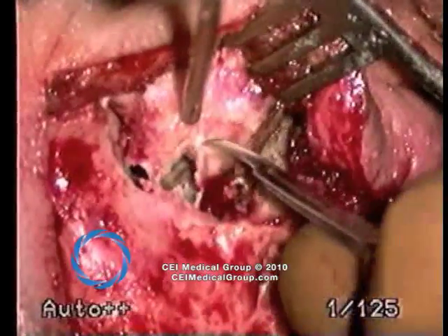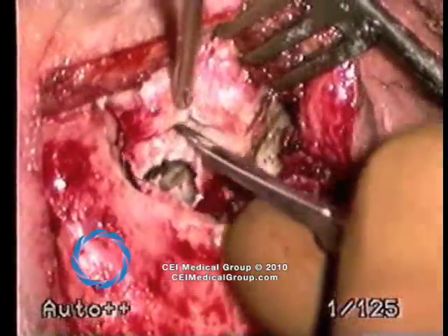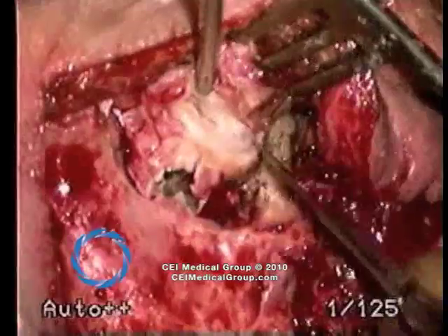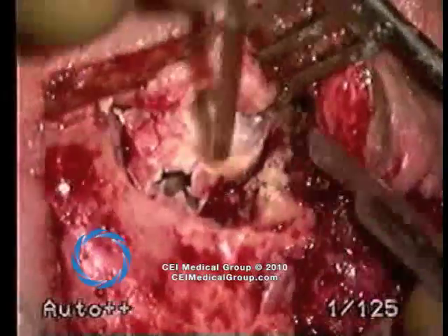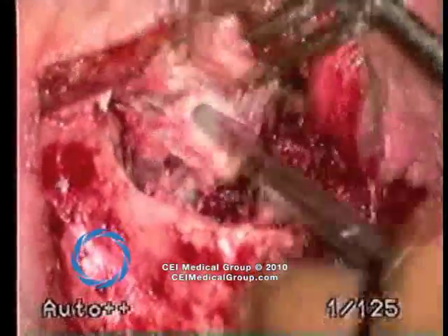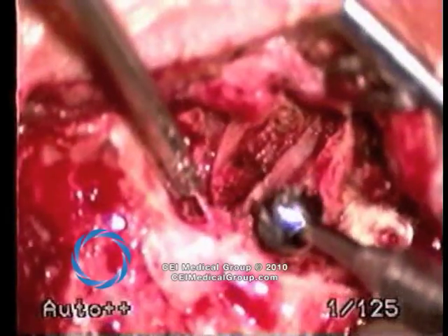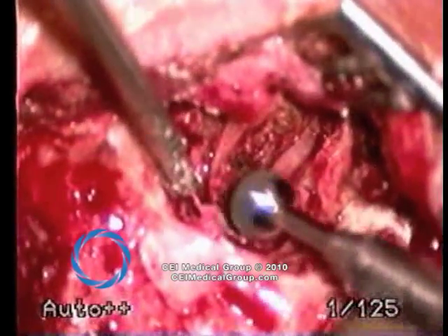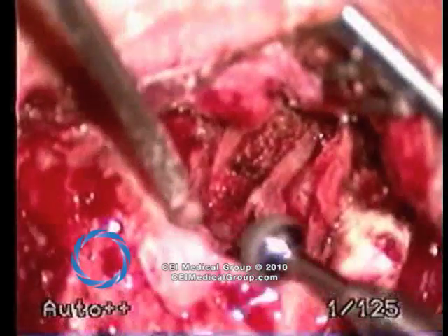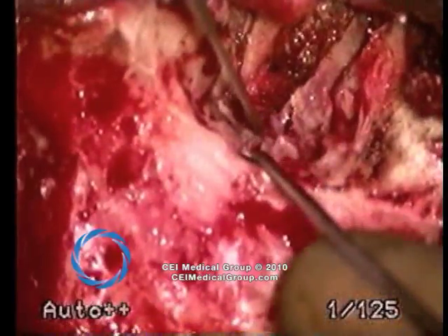In many patients, the skin surface turns posteriorly and on the back side of the margin of the concha, a skin flap has to be created in order to allow reconstruction of the mastoid. Here you see a 15 blade incising just such a situation. Skin flaps are frequently trimmed as redundant skin is present. A cutting burr is necessary to remove the margins of the mastoid bowl, and it is imperative that the surgeon remove all skin from the mastoid bowl before completing obliteration.